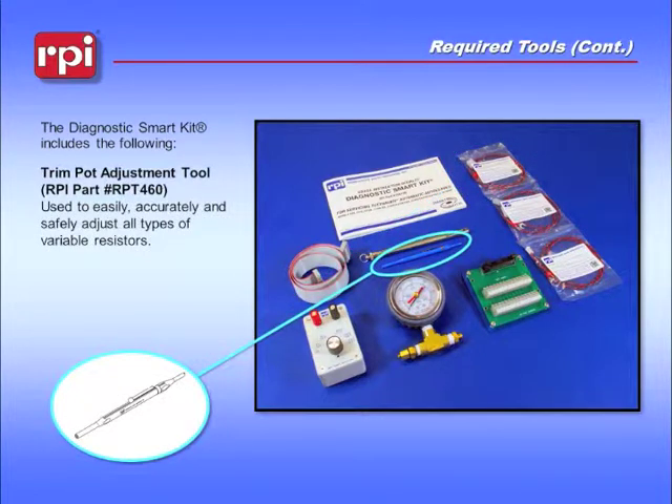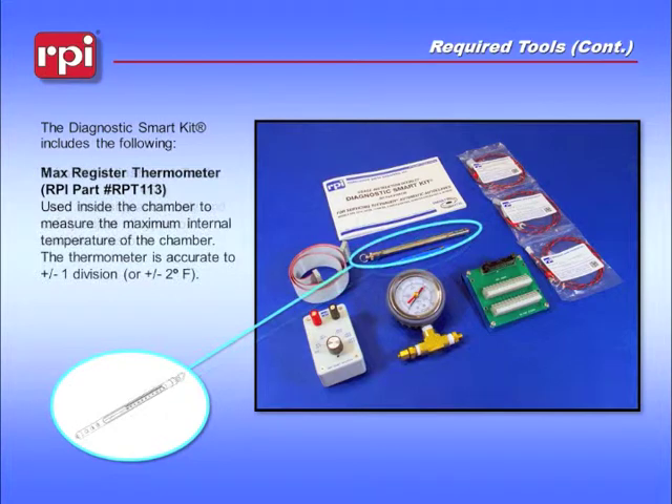The trim pot adjustment tool, RPI Part Number RPT460, is used to easily, accurately, and safely adjust all types of variable resistors. The max register thermometer, RPI Part Number RPT113, is used inside the chamber to measure the maximum internal temperature of the chamber.